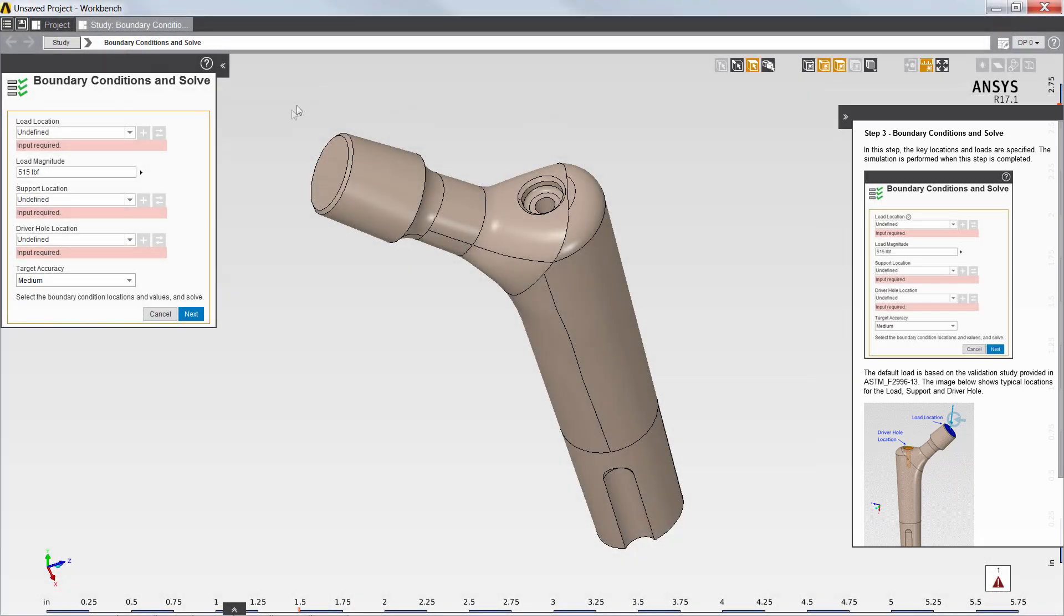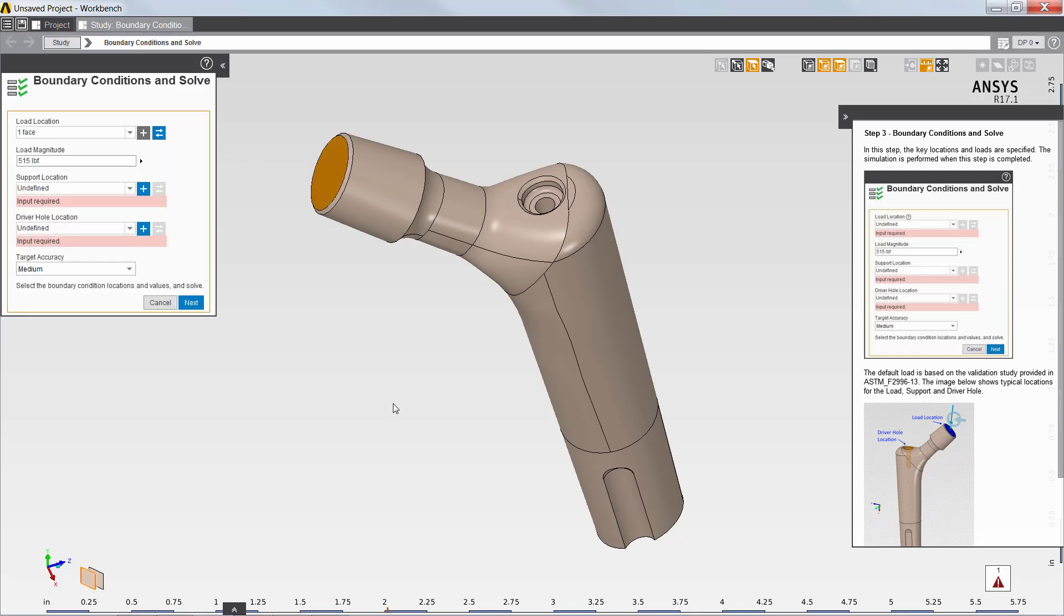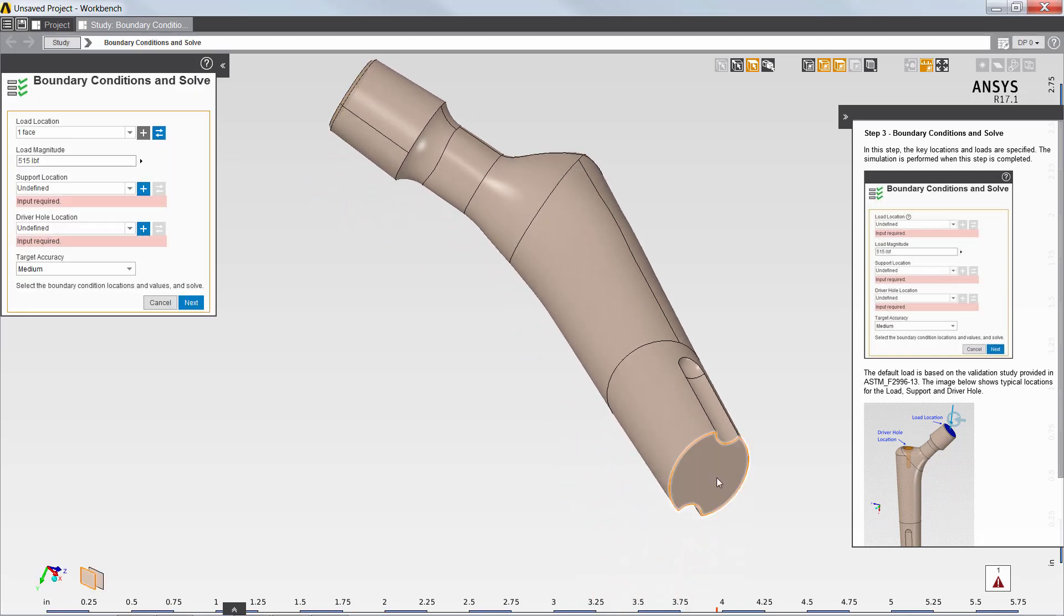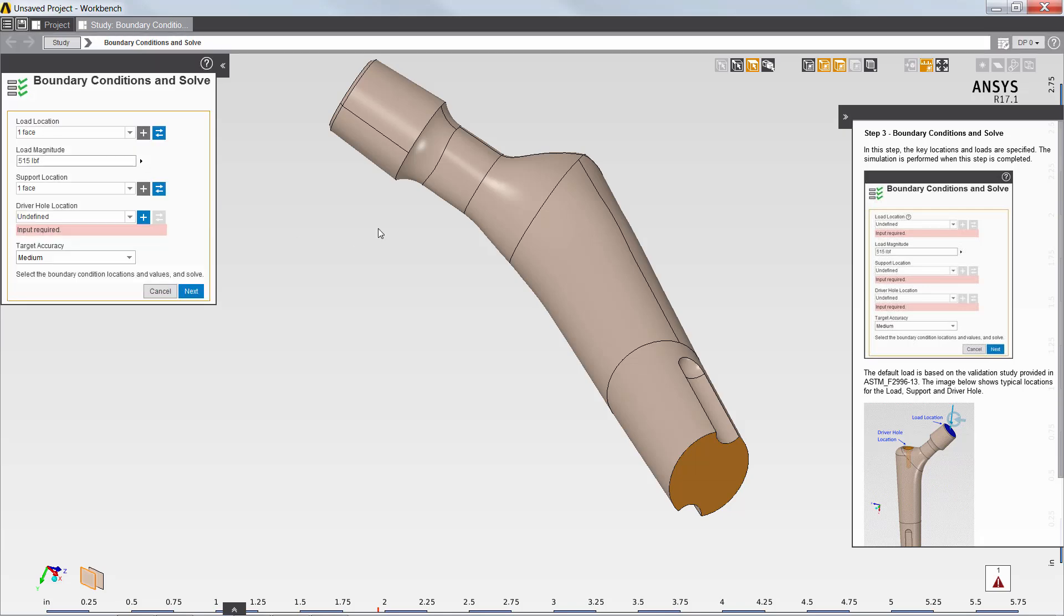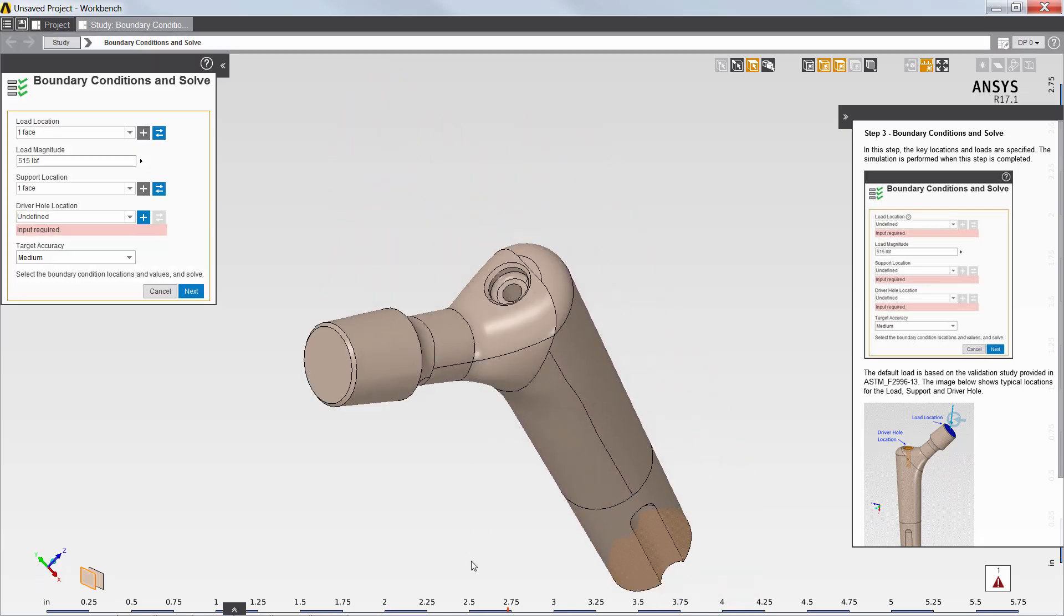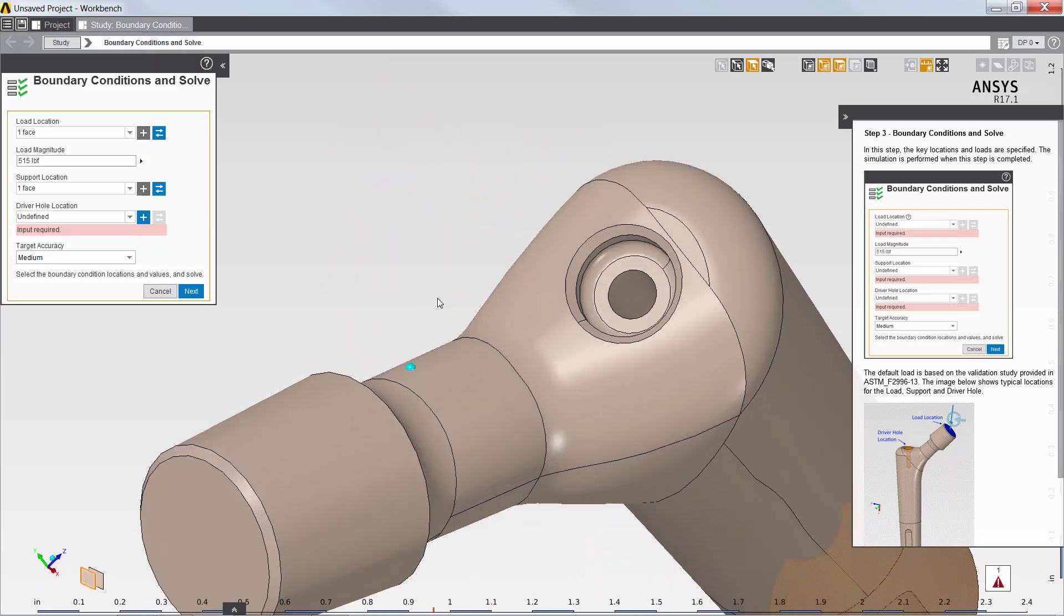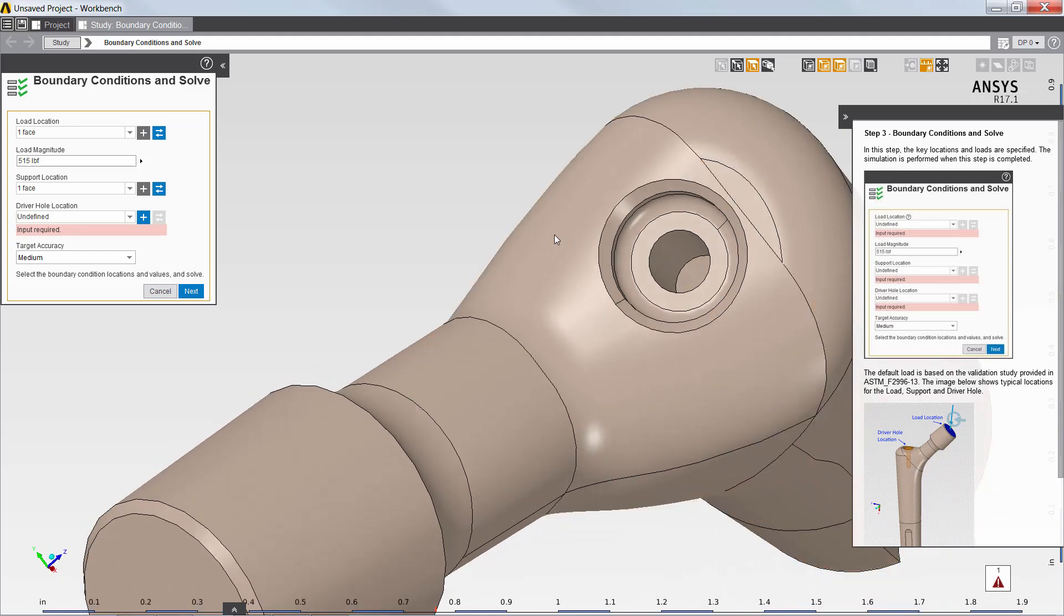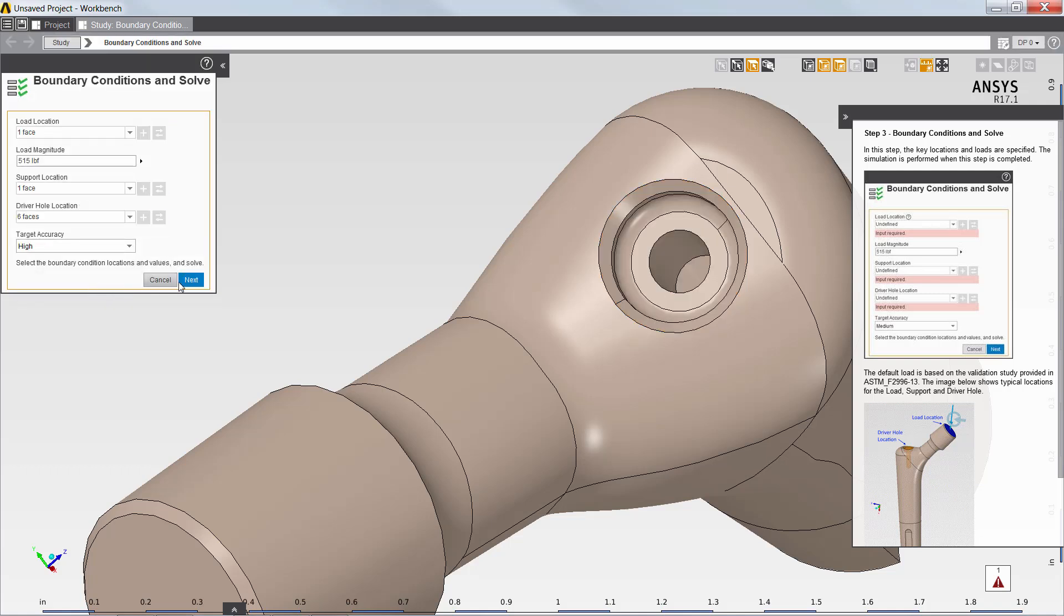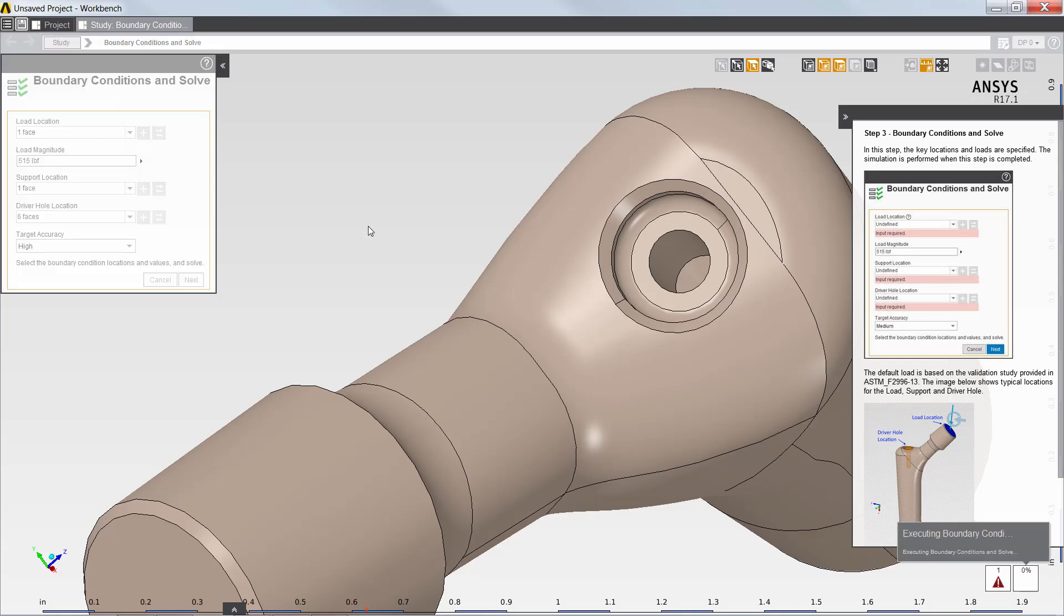Based on the guidance provided by the context help, I'll define the location of the load, the location of the support, the driver hole location, and I'll also select a target accuracy and execute the solution.